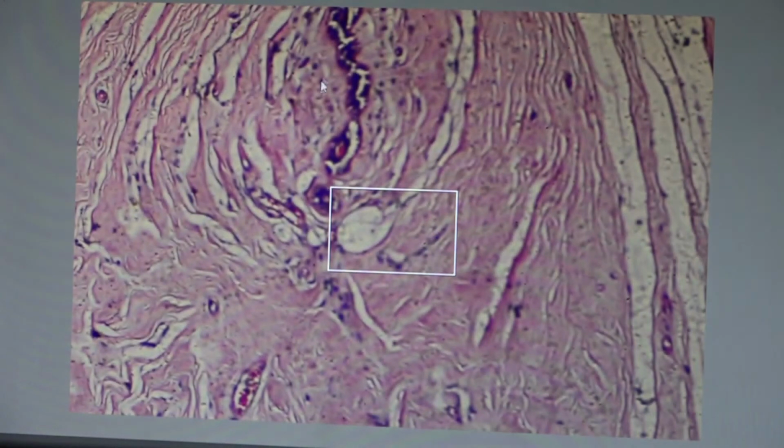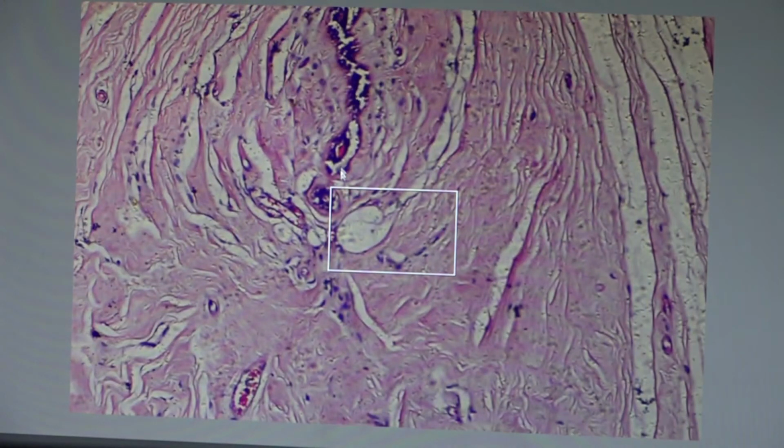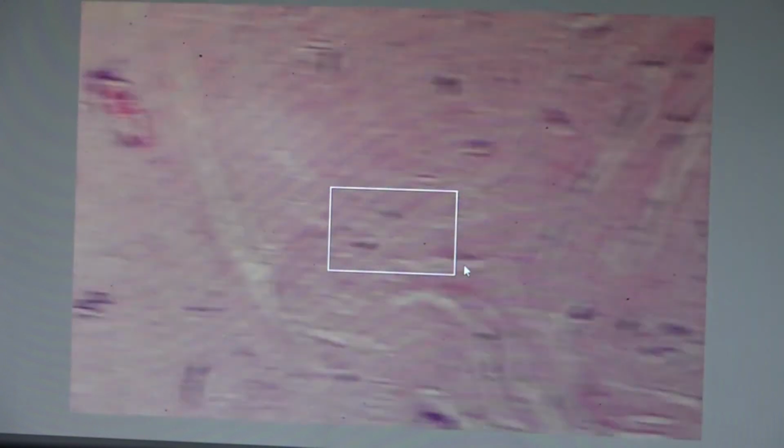of this section. These are the benign-looking glands, glandular epithelium, and this is the benign-looking stroma, a fibrous or smooth muscle lesion. Mainly two elements, gland and stroma, gland and smooth muscle. This is called adenomyoma of the myometrium.